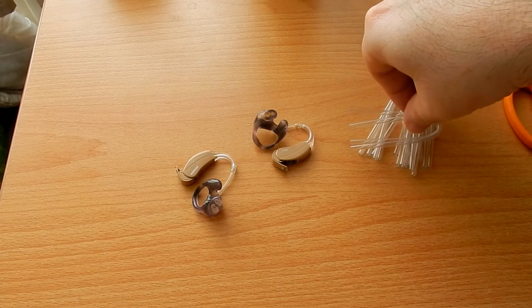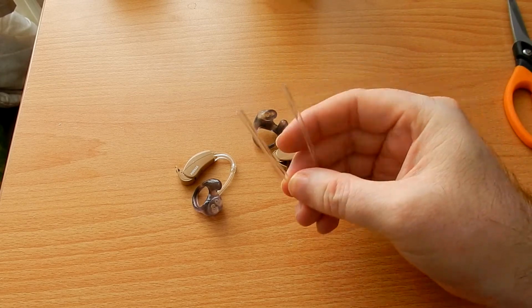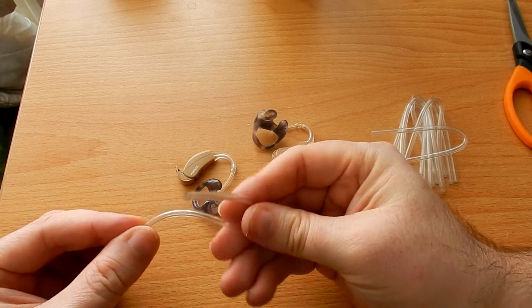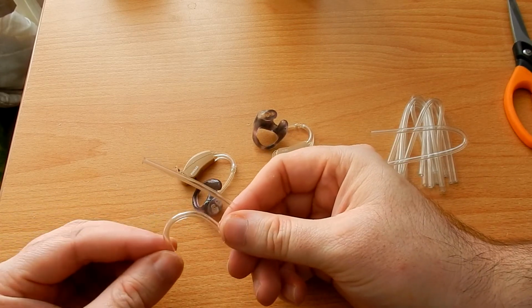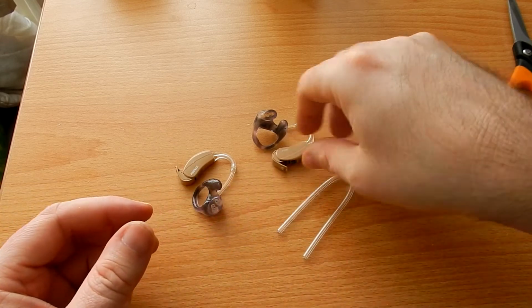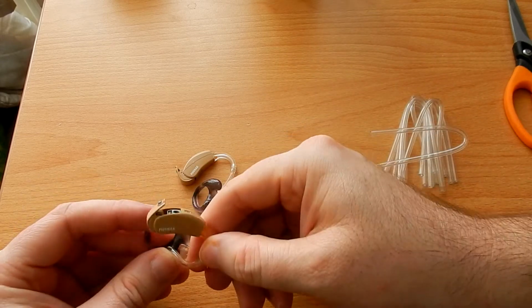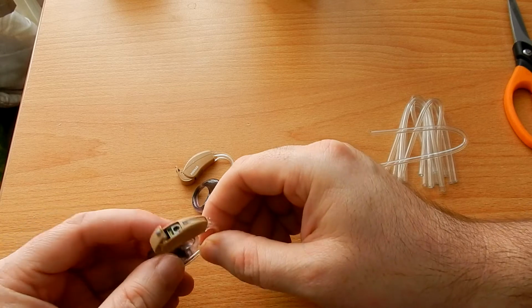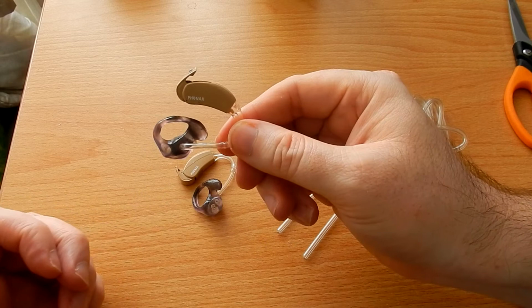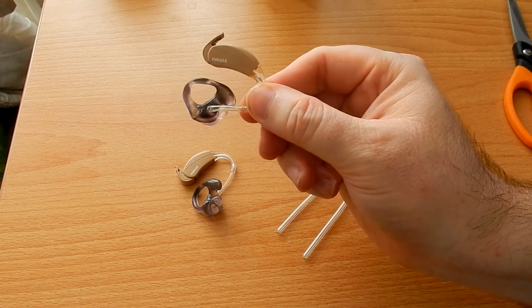Every so often you have to replace the tubing because they are made of silicone, and after a while they tend to go hard and brittle, which, if you look at the ones on my hearing aids at the moment, they've gone really quite hard and gone off. I've actually had them on there for a bit longer than they should have been.